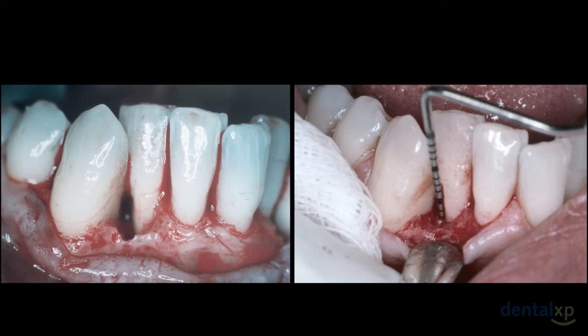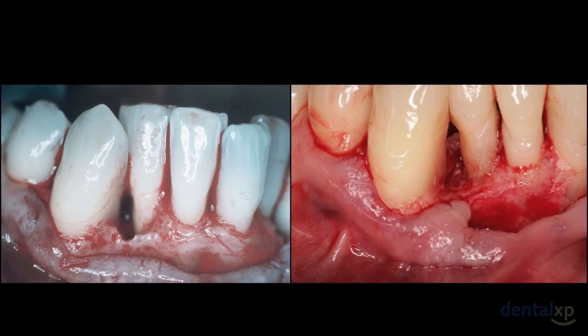Fortunately, this patient returned to me just a couple of months ago, and I was able to do a small reflective flap to find that in fact what appeared to be bone was still in place and had not degraded back to having a defect. My main reason for treating the patient was because of the crowded teeth, and I want to say initially he did not want to undergo orthodontics. He did get some granulation tissue between the crowded teeth, and you can see the major root proximity issues between 25 and 26. So I was able to get a nice photograph 12 years later.